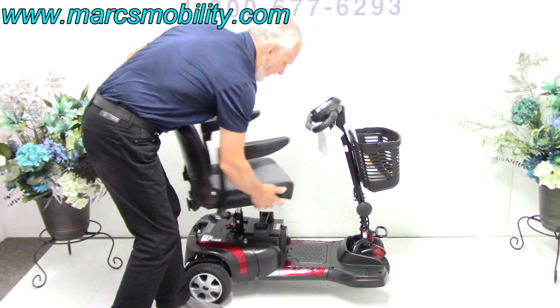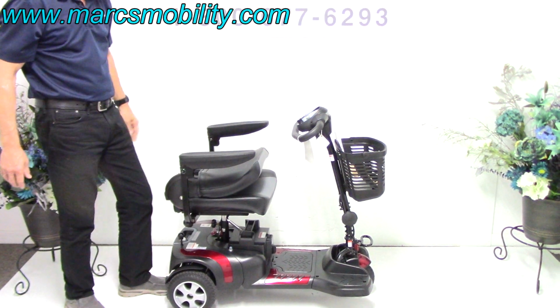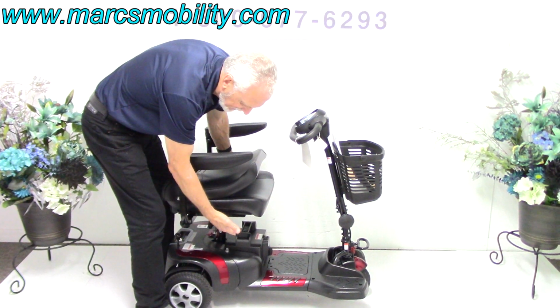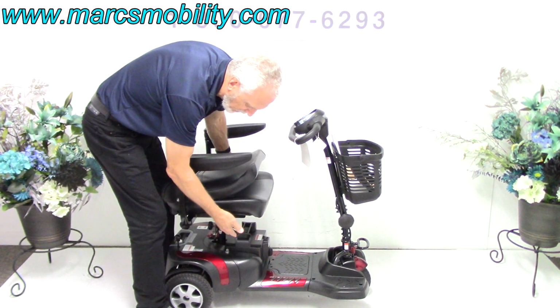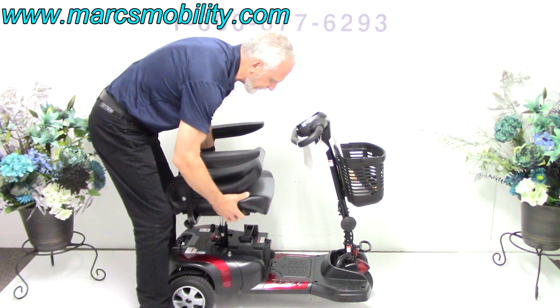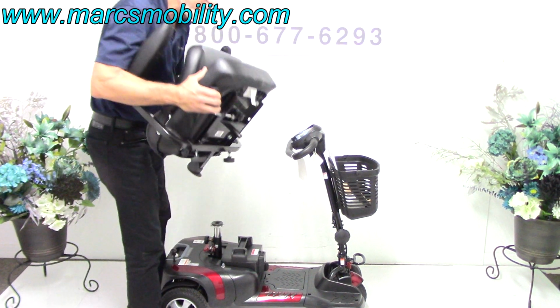Let me swivel the seat. So if you're going to take it apart, fold the seat down first. Put your left hand under the seat, your right hand on the lever, because you have to push the lever up to unlock it like this. You can feel it's unlocked when you do that. And then pull straight up. Don't go back, don't go forward. Pull straight up because it's really tight.